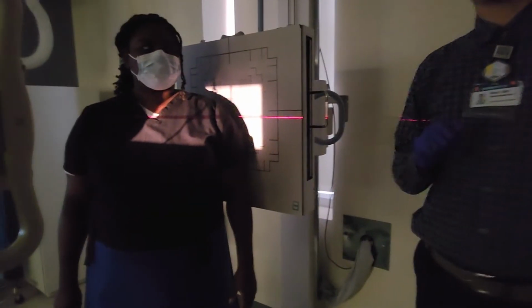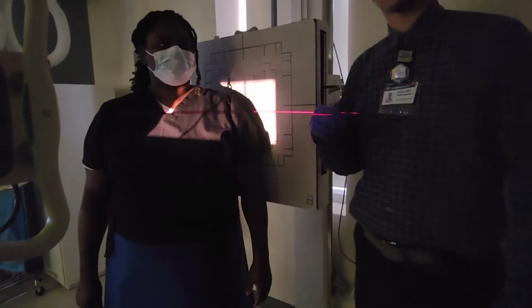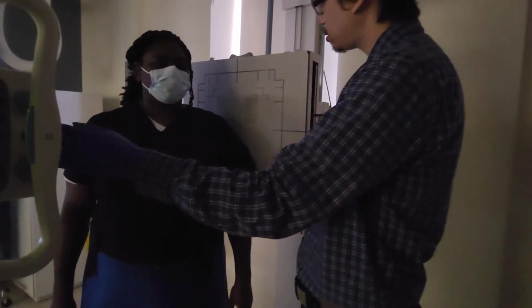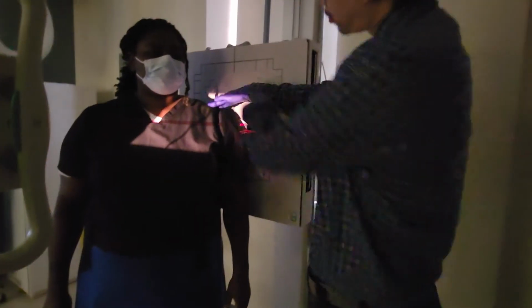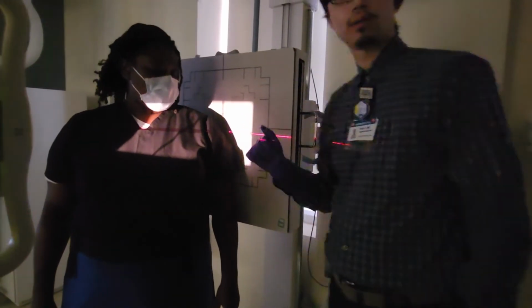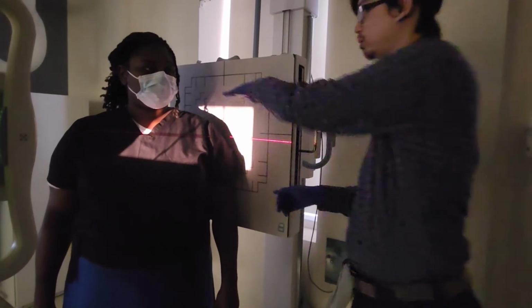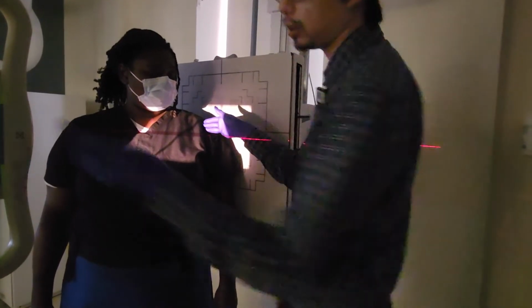So our centering for the Grashey is going to be a bit different now compared to those other shoulders. What we're going to do is, once we have our patient nice and rotated, you're going to find the top of the shoulder and you're going to go down about 2 inches, right? Because we're trying to center to that scapulohumeral joint. So find the top of the shoulder, go down 2 inches. Okay, so I need to raise this up just slightly.